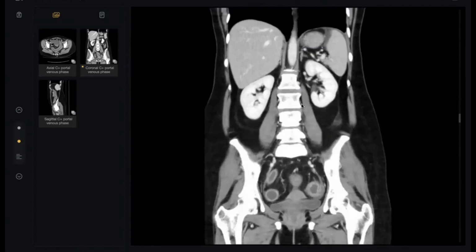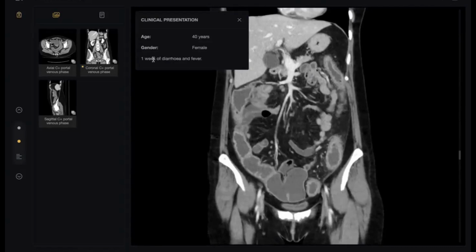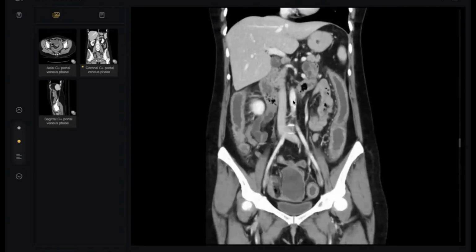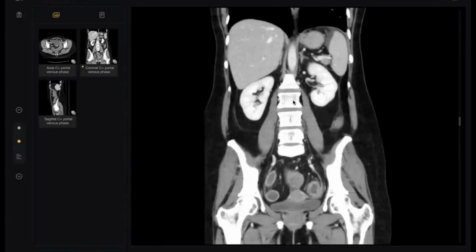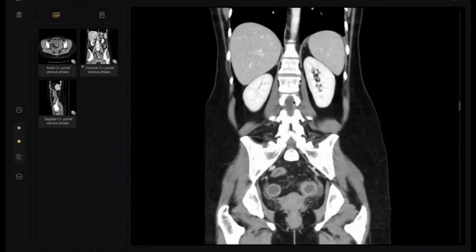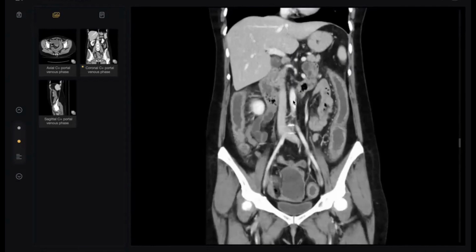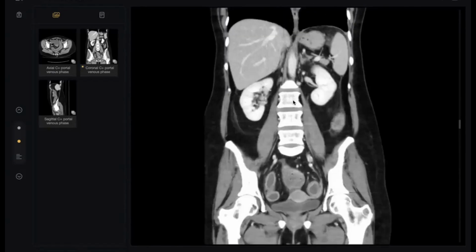Number one, the sacroiliac joint is normal. Number two, from the history the patient looks acute: one week of diarrhea and fever. It looks infectious from the history. From the CT, it is borderline, 50% infectious, 50% ulcerative colitis. So better to give both differential diagnoses. Don't be definite in borderline cases. You did very well when you talked about going beyond the case, and this is very, very important: what will you do to rule out other associated diseases or complications, like biliary tract problems, like the sacroiliac joint? Very nice. Thank you so much, doctor.